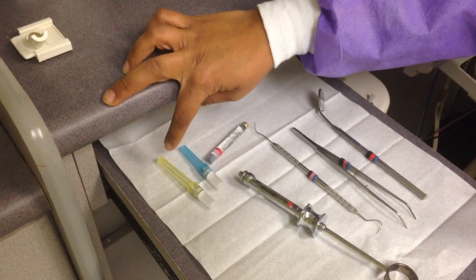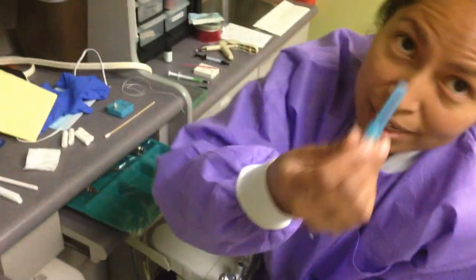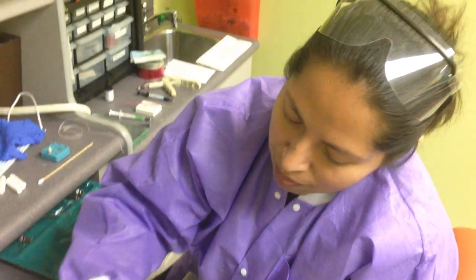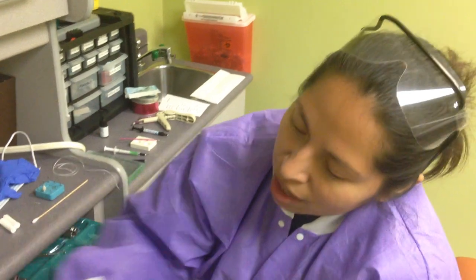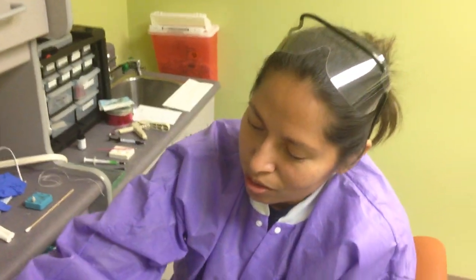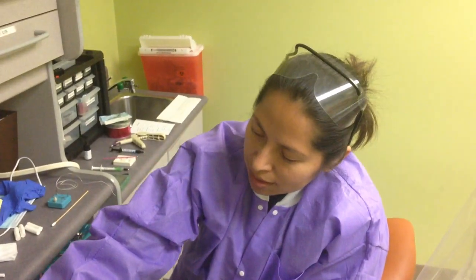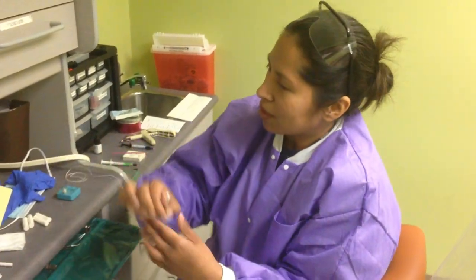We start with the long needle. The long needle is for mandibular blocks. The short needle is for maxillary injections. So whichever your doctor prefers — Dr. Grego prefers the long needle always.